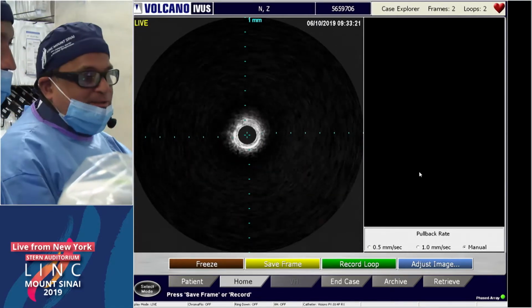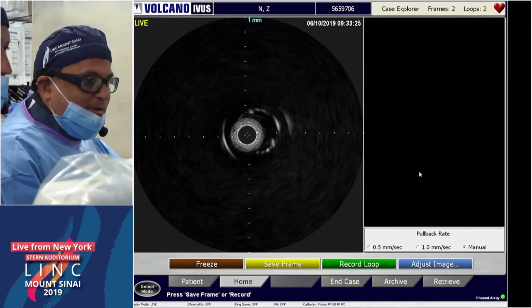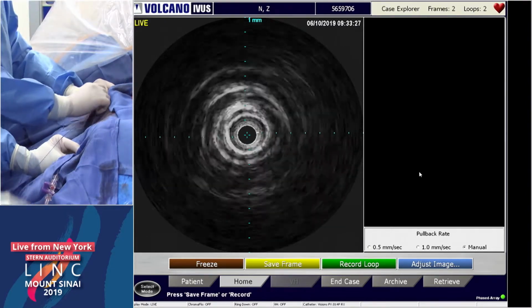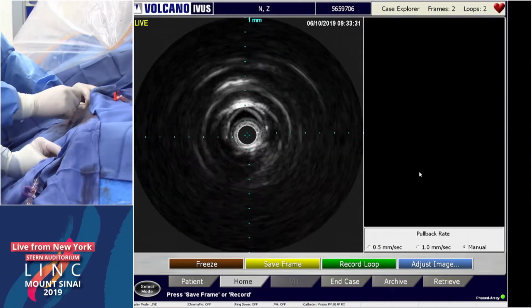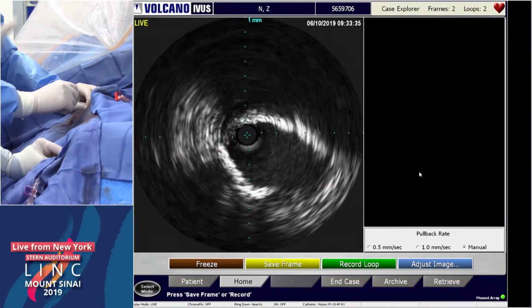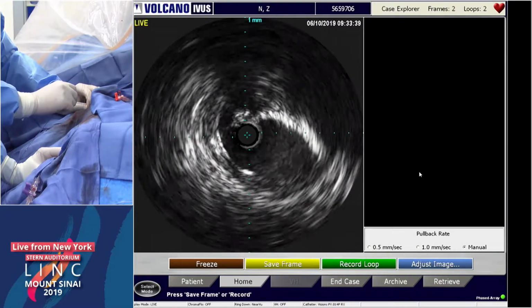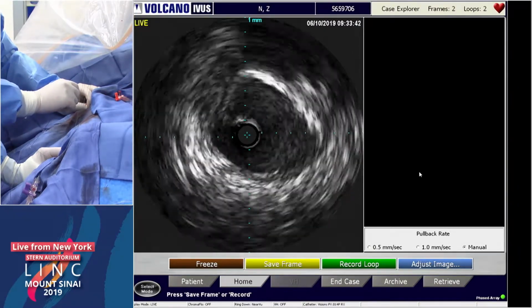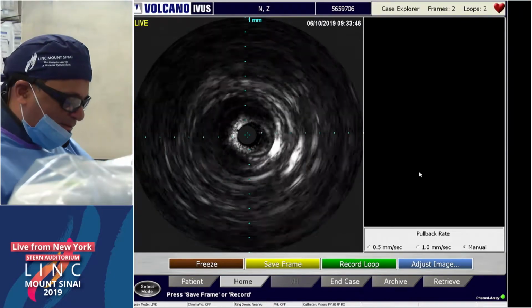I know Chris has a lot of experience using CSI, and I think that's definitely another device that could work here. However, with the luminal gain, we really like the Jetstream. So eccentricity of the plaque doesn't bother us. Now look at the luminal gain there. That's our lesion. We almost tripled our luminal gain here, with IVUS, and we're very, very happy. We're just going to capture the filter, but that's our algorithm here, Dirk.